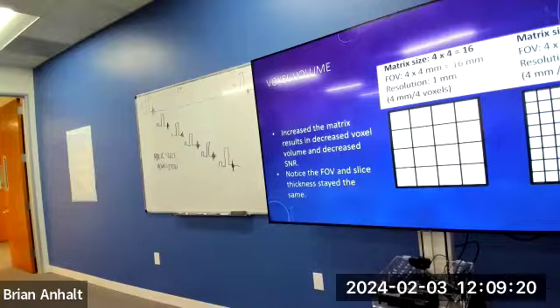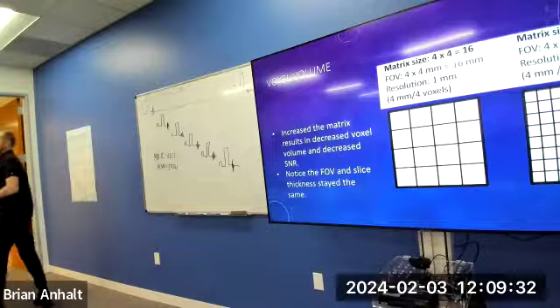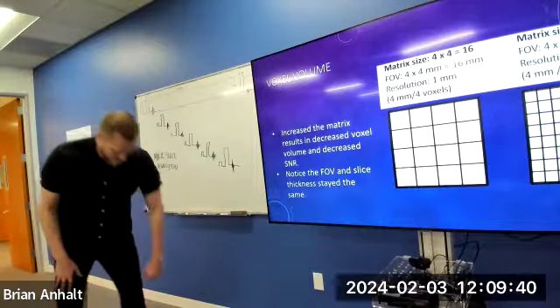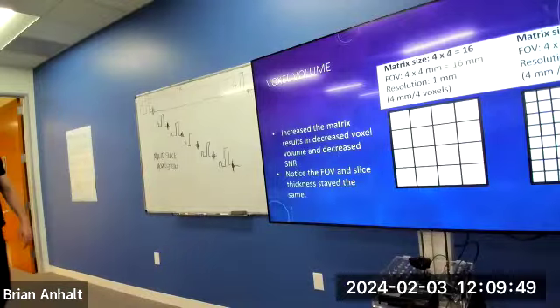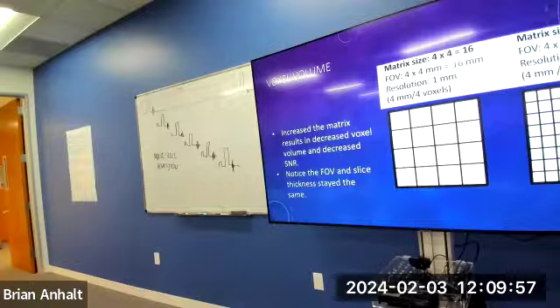Right now, we know the shorter the TR, what happens to our contrast? If we lower our TR, what happens to contrast? Can't remember. What does TR control? T1. T1 contrast. So what happens if we lower the TR? Increases T1 weighting, right? So we get T1 weighting with lower TR. So we get better T1 weighting to a certain point. If we decrease it too much, then it's bad. What is the negative trade-off of reducing the TR? It lowers our SNR, right?